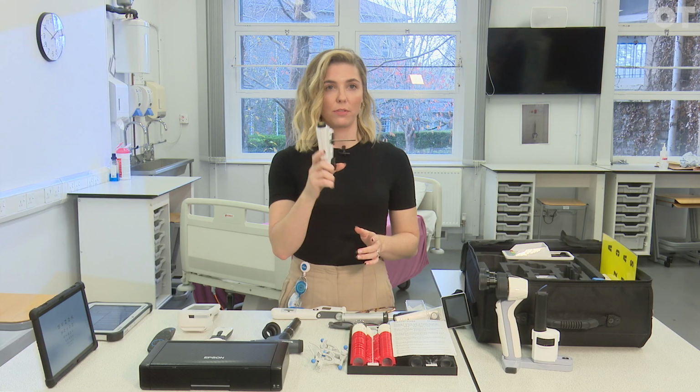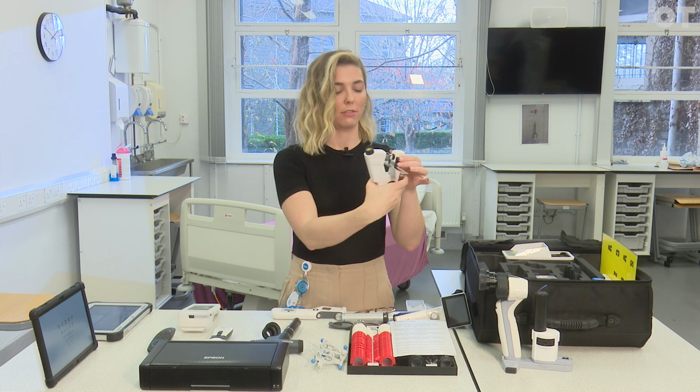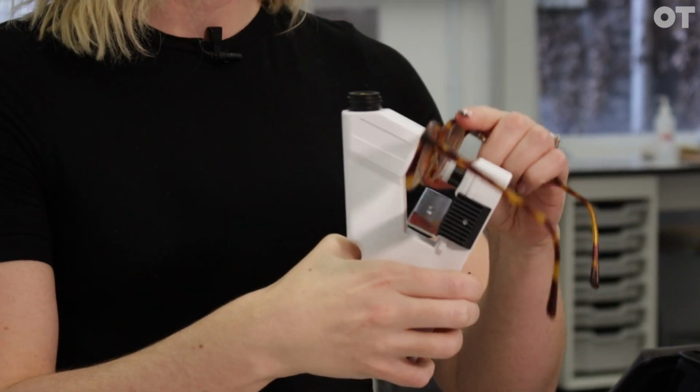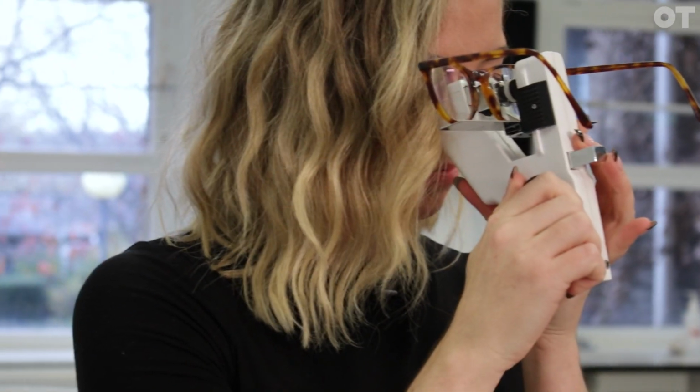We use a portable vertometer, which is really handy. They're dead simple to use. You've got a little shelf there to pop your spectacles on, the same as you would use any manual vertometer. Pop the glasses in, line them up, and then read off what they are.